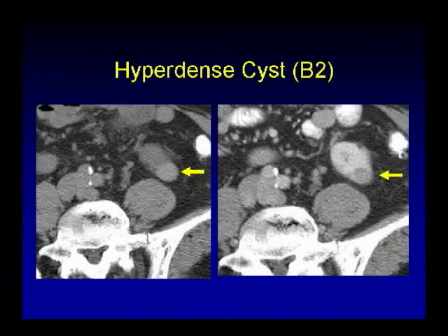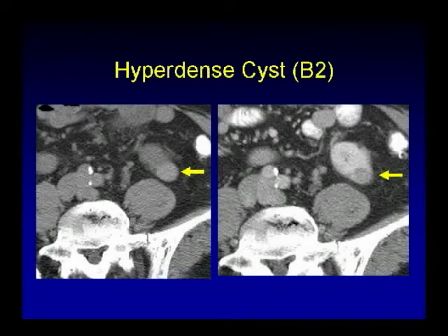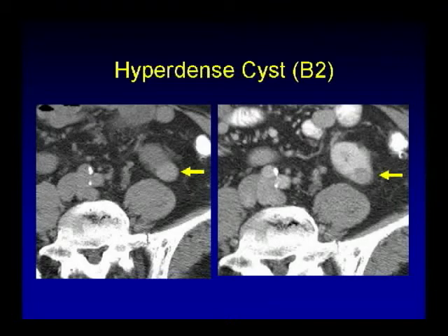Here's another example: an intrinsically dense lesion from the left kidney on the non-contrast scan, and on the post-contrast scan there's no obvious enhancement. This is a hyperdense cyst, less than 3 cm — again Bosniak 2, benign.